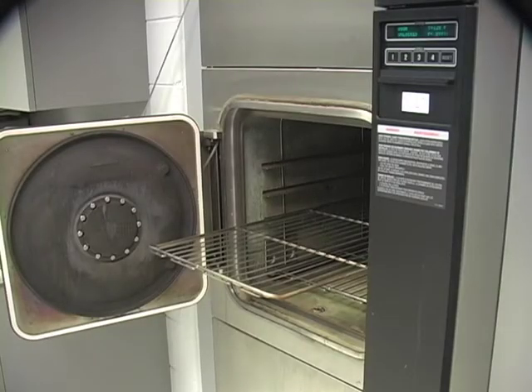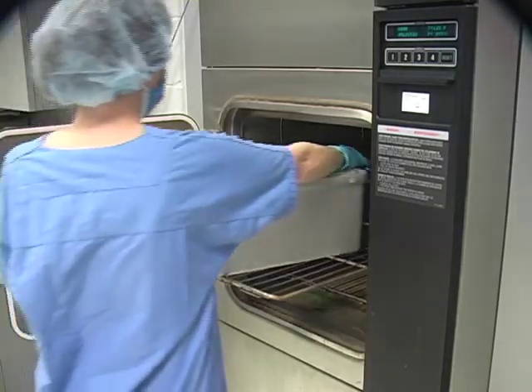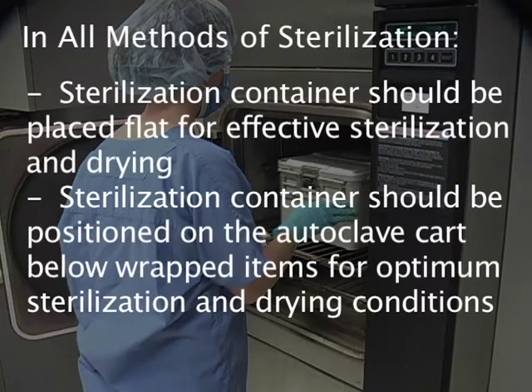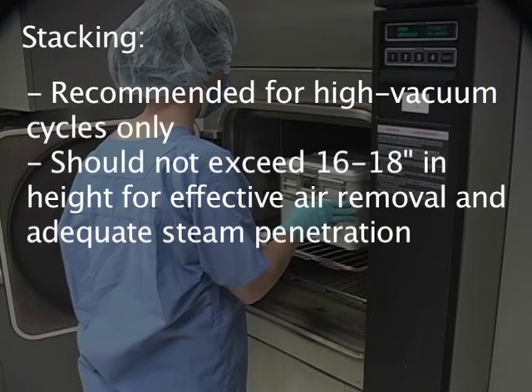Run the desired sterilization cycle according to the instructions for use. Sterilization containers should be placed flat for effective sterilization and drying, and should be positioned on the autoclave cart below wrapped items for optimum sterilization and drying conditions. Stacking is recommended for high vacuum cycles only and should not exceed 16 to 18 inches in height for effective air removal and adequate steam penetration.